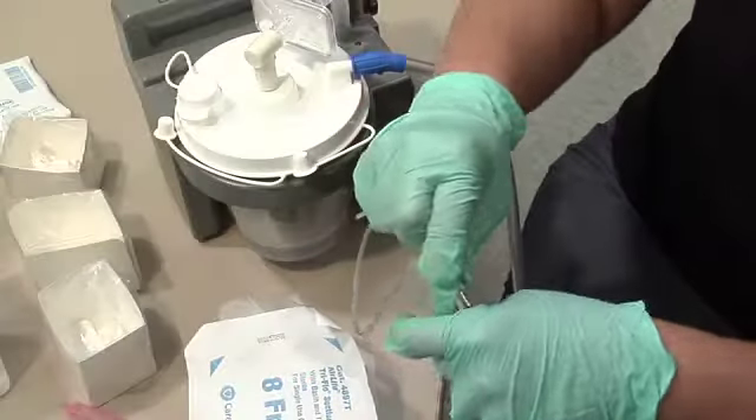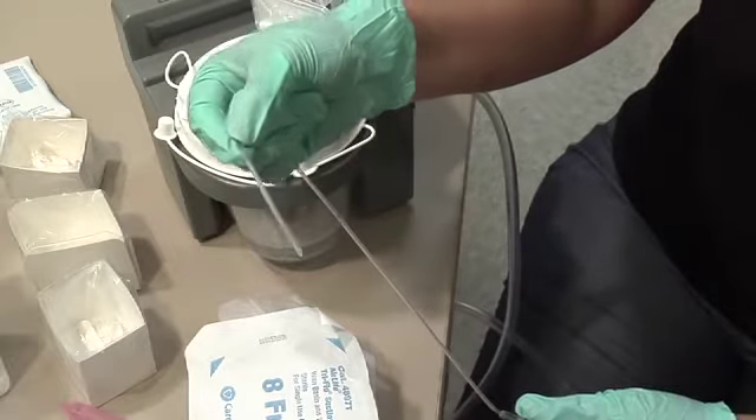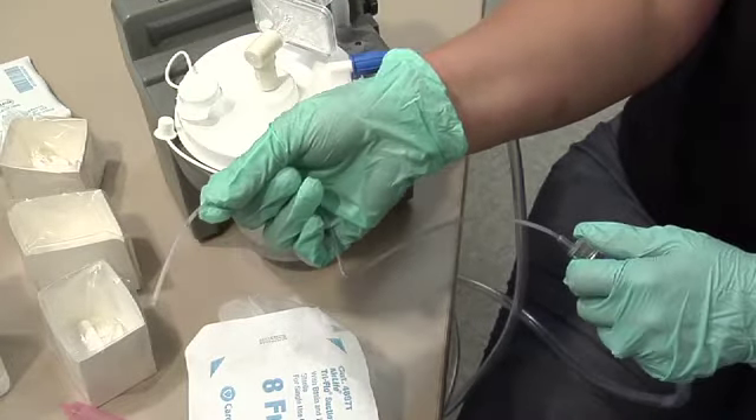Attach the top of the catheter to the suction tubing. Hold the suction catheter at the absolute length of catheter insertion, also known as the measured length. Each student will have their own absolute length of catheter insertion. When suctioning, the catheter should not be inserted deeper than the absolute length of catheter insertion.